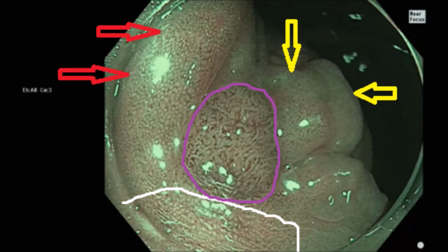Couple of things that are important here. First of all, we're examining in NBI because NBI gives us, I think, clearer definition of the pits and clearly of the blood vessels. And we've got the near focus on. We're using magnification along with our high definition scope to get the best evaluation of the pits that we can.